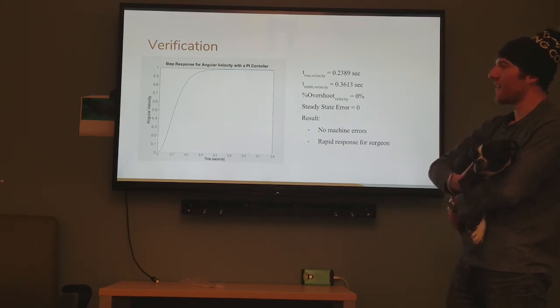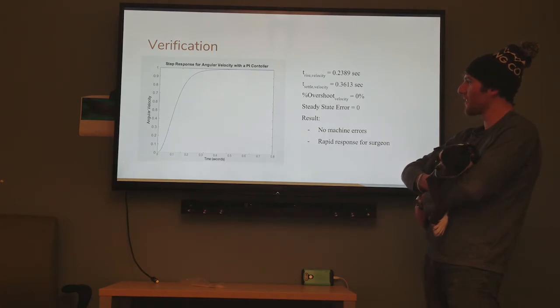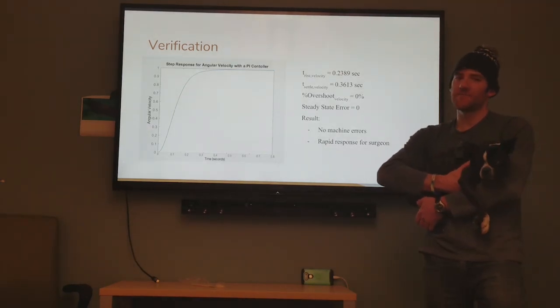And when we set out with our design, those were important to our feedback system so that our robot would accurately reflect the intent of the surgeon.